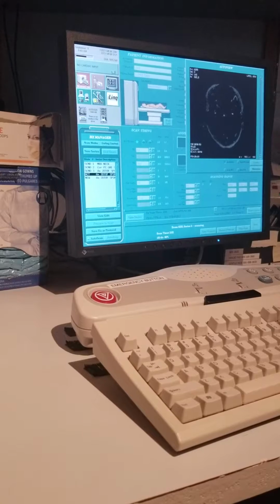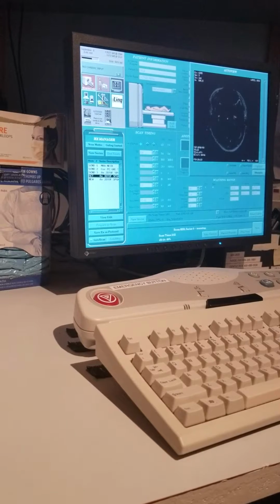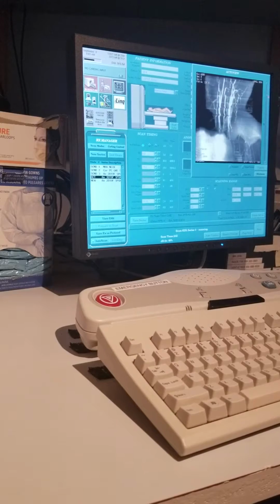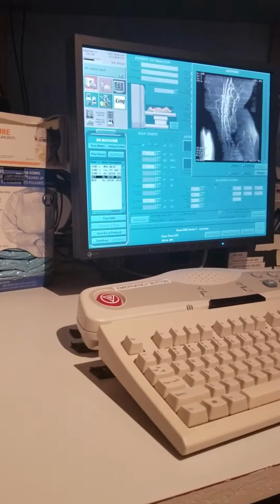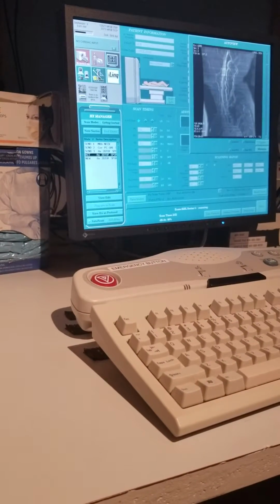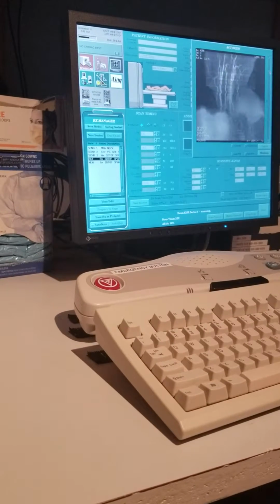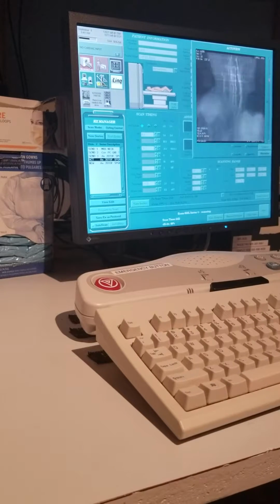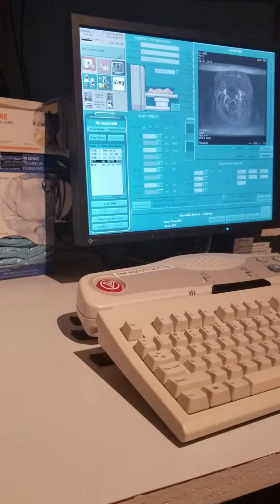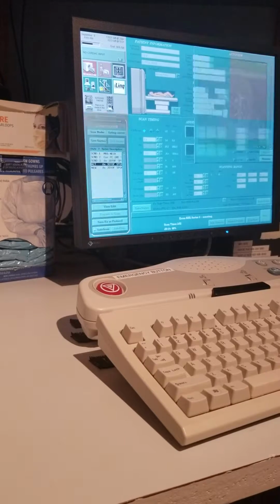It's actually at the very start of that scan. You have to scroll all the way up. What's that in the front? It's the chest. So what we're going to do is take out all of this, and it'll improve the quality of the image. This is not what you turn in. Use this image, and you're going to cut out all of the skull, the orbits, and other things, and you're going to do it over here.